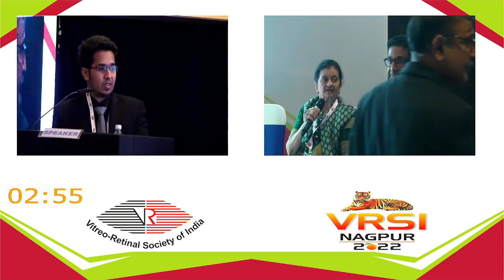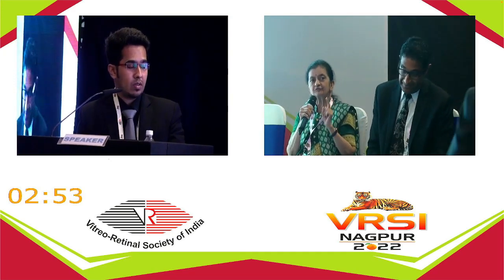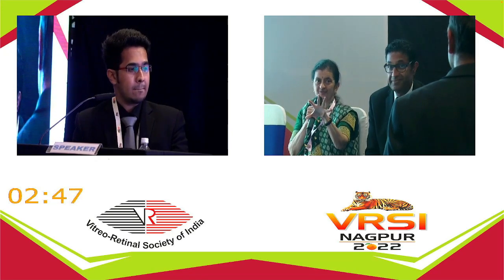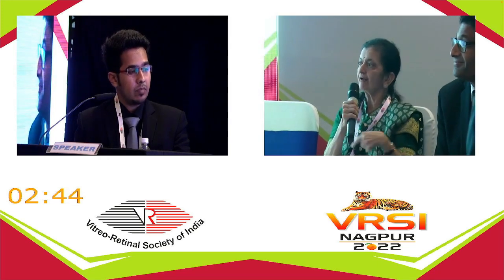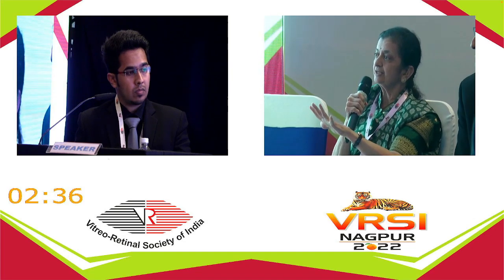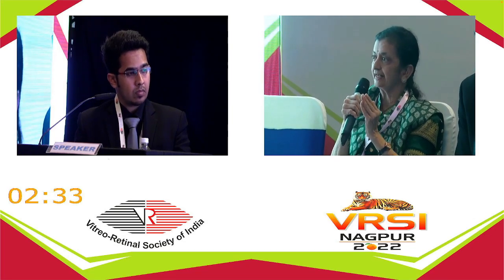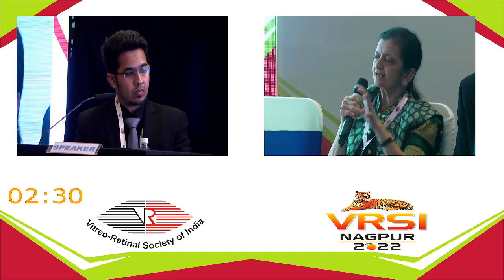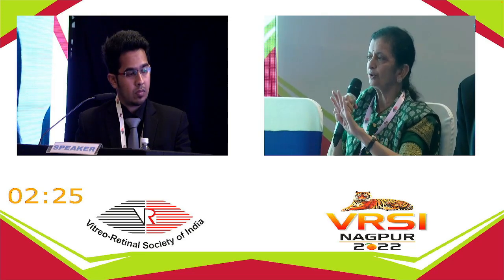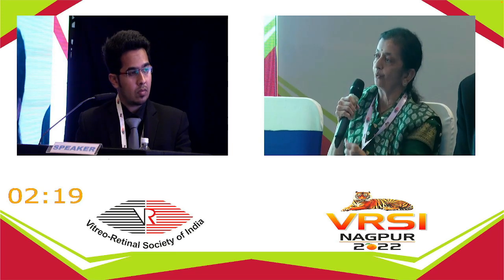Dr. Deshpande, a point from your side. Here, the size of the hole, we are not sure, because it is totally covered up with hematoma. So you have to go quite far off to do barrage laser, and we are not sure whether the hole would close in such cases. Naturally, close observation is very much indicated. I think such people usually go for vitrectomy. The hole will not close if such a big hematoma is there. We are not sure how much is the size of the hole.